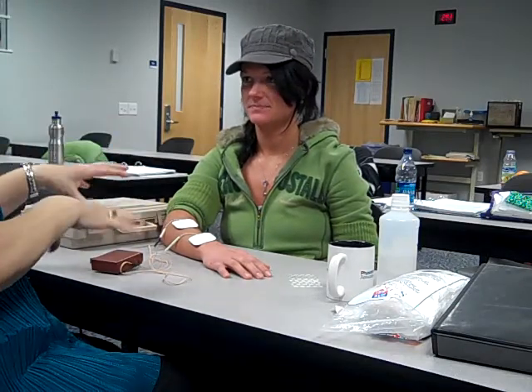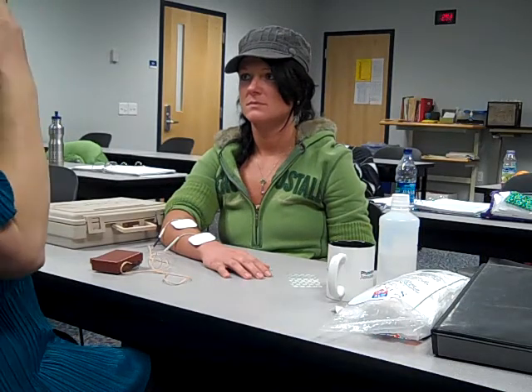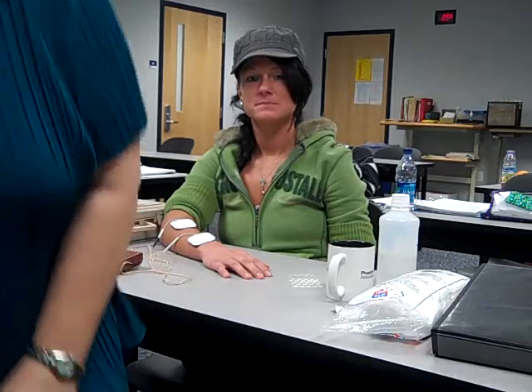After I take the electrodes off, I'd check her skin to see if there's any redness or anything like that, and then I would send her home with a unit. She can do the TENS treatment for low rate up to four times a day — maybe when she gets up in the morning, lunchtime, after work, and before she goes to bed. Four times a day would be about right, again between 20 and 60 minutes each time. If she doesn't have time in the morning to do 60 minutes, maybe just 20 minutes. Any questions? Thank you very much.